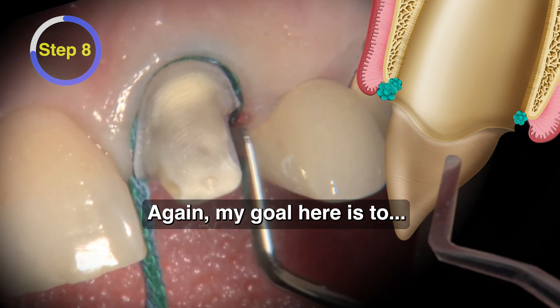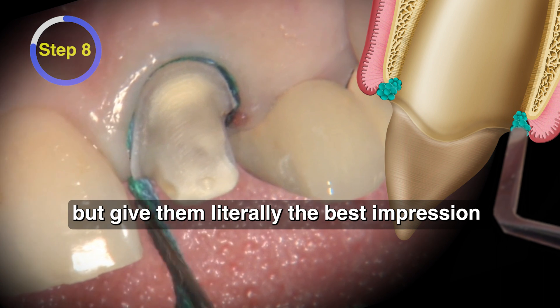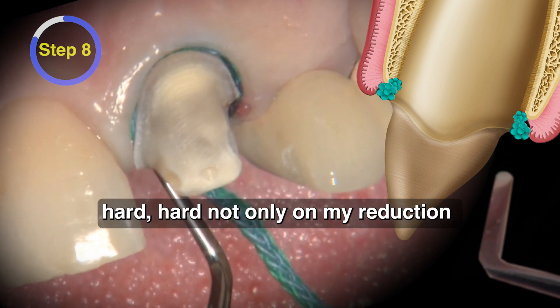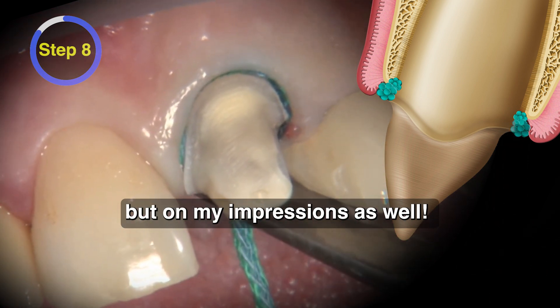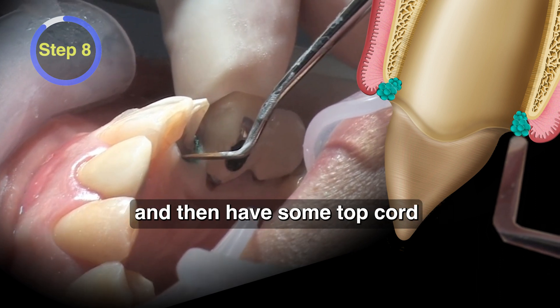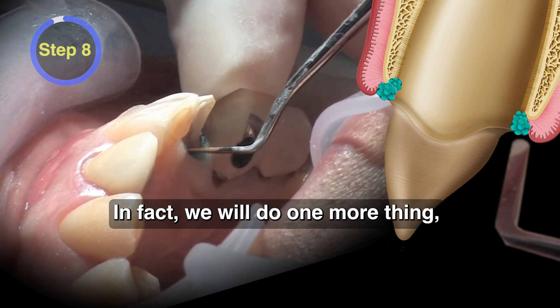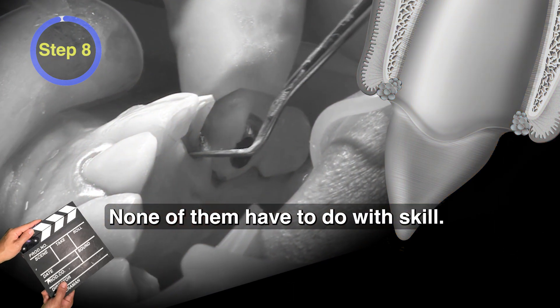My goal here is not only to reduce enough for the technicians, but to give them literally the best impression I'm capable of doing, because I know they're judging me hard — not only on my reduction, but on my impressions as well. So if I can use a two-cord technique with the top cord having some epi in it so we don't have any bleeding, I'm going to do that. We have a three-part approach to taking great impressions, none of which have to do with skill.